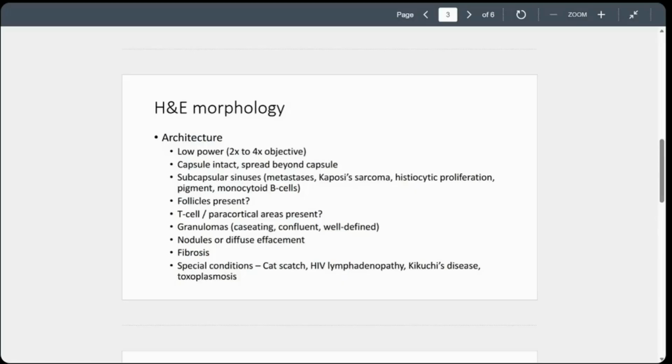It's only when you look at that you decide, are these follicles or are they nodules? So I quite often use the terms nodules and follicles interchangeably in the first assessment. So basically, is it diffuse and the same in all directions, or does it have a nodular slash follicular appearance? If it does, then you can look at them and decide, are these follicles or are they nodules?